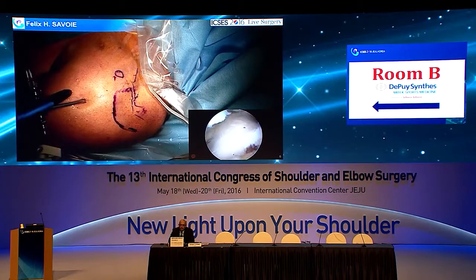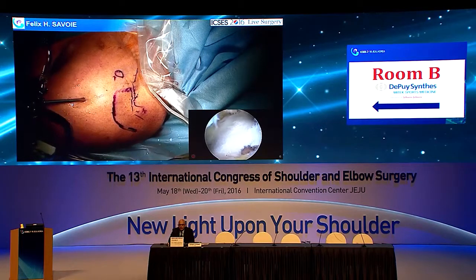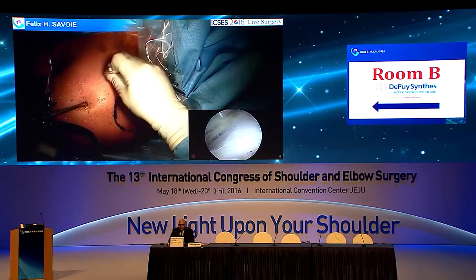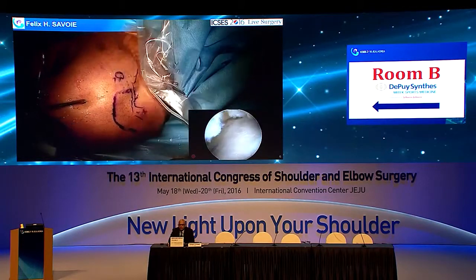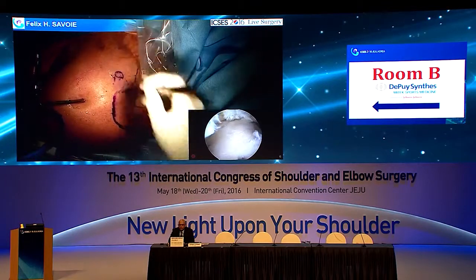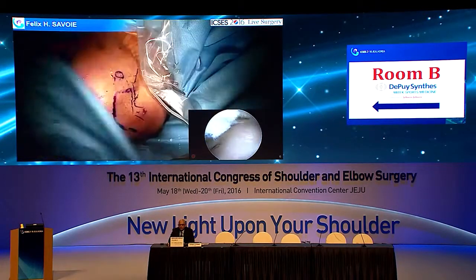So our next step is to make an anterior portal and go look at our spinal needle. Just look at the front and make sure that we can get this in where we want, and we can, so that's a good portal. A little bit lower than I had drawn. I think I'm not used to using a pump. And so cautery, the cautery is here.